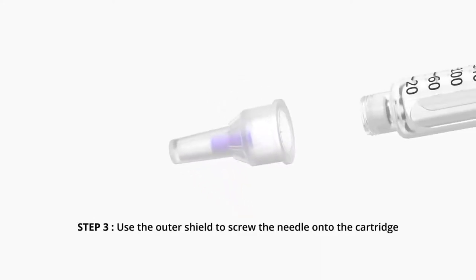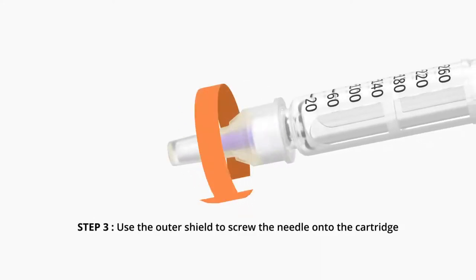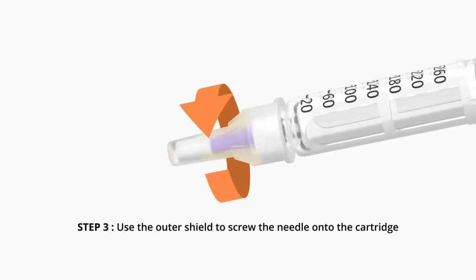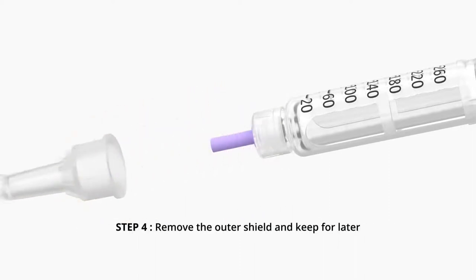Step 3. Use the outer shield to screw the needle onto the cartridge. Step 4. Remove the outer shield and keep it for later.